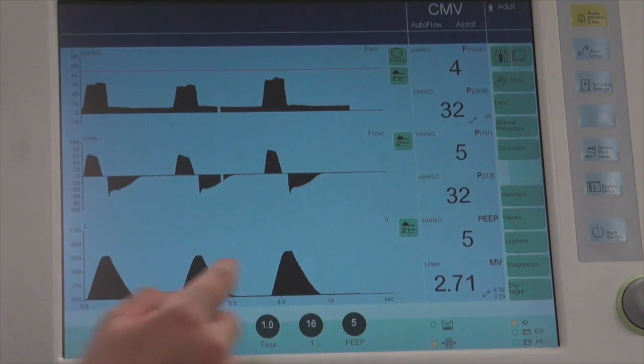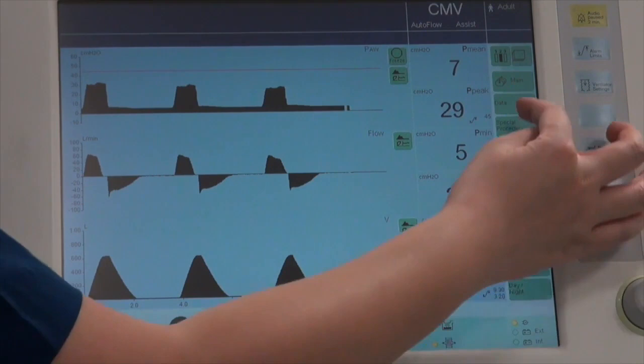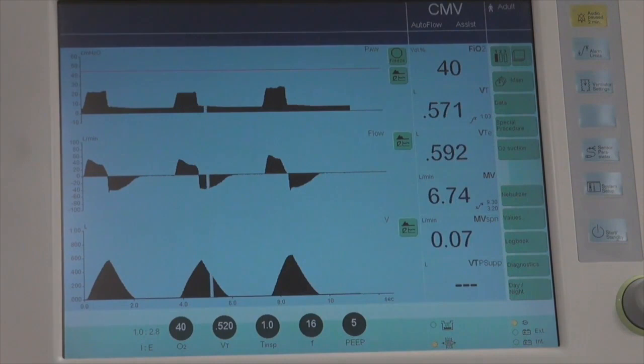On the ventilation page you can see the pressure-time graph, flow-time graph, volume-time graph, and measured values. If you want to look at other measured values, you can navigate to the third page or the first page.